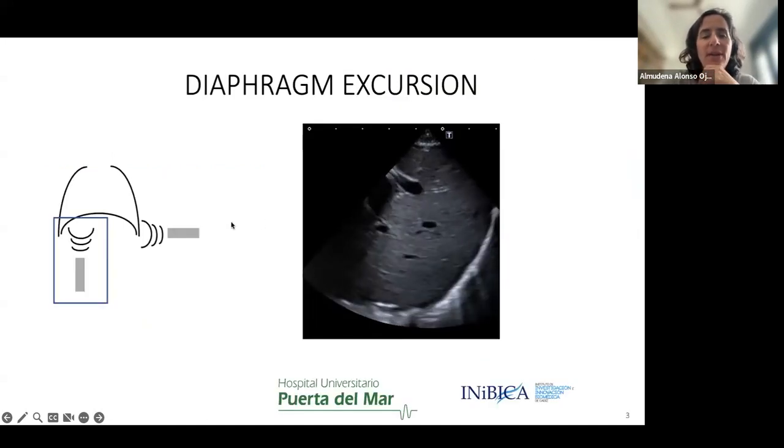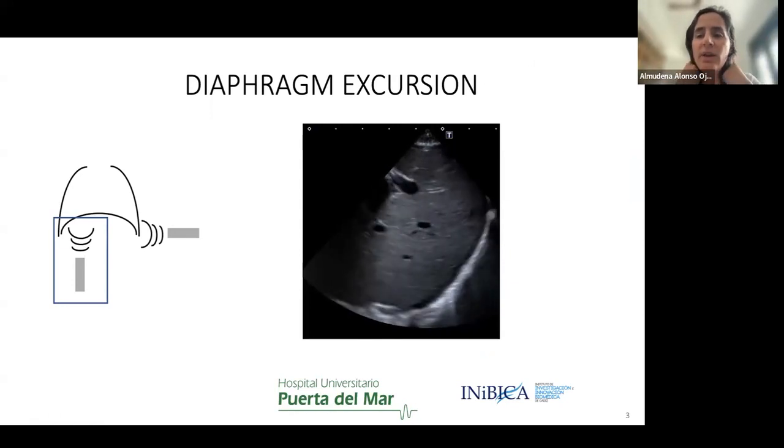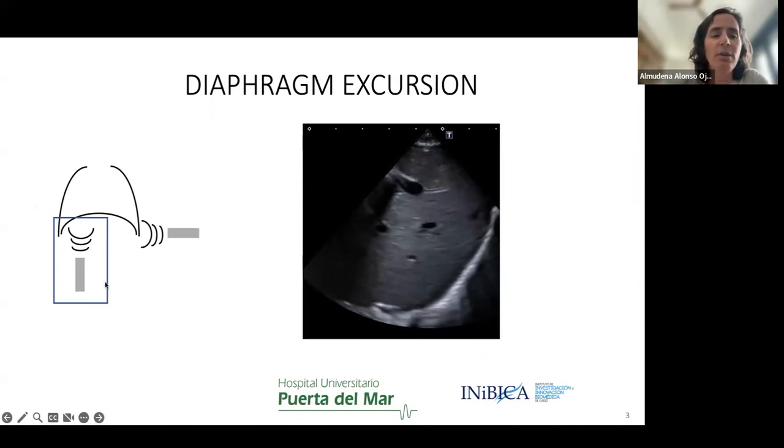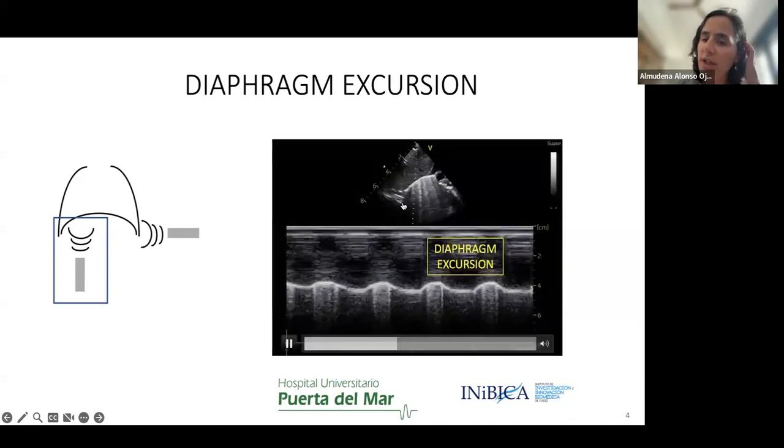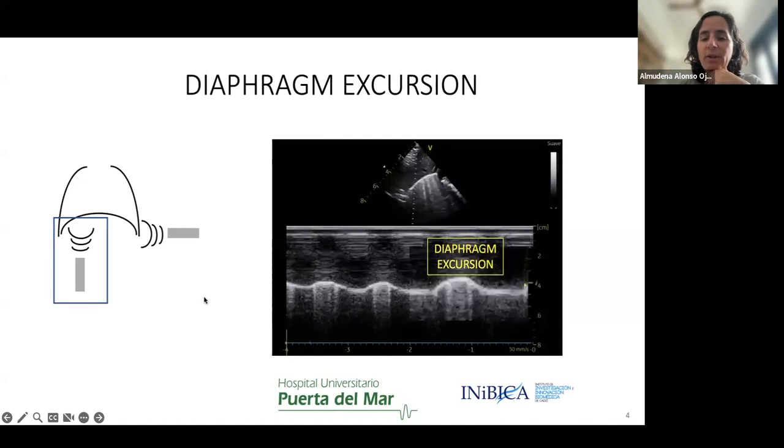This is the first measurement and the most logical one when we think about how the diaphragm is functioning. The first thing that we should be aware of is the displacement of the diaphragm upwards and downwards during the respiratory phase. In this first approach, we are looking at the diaphragm from a subcostal view at the level of the mid-clavicular line. You will see this image here in which you're watching the liver, and using the liver as an acoustic window, you can see this hyperechogenic line here, which is the diaphragm. You can use M mode there to measure how the diaphragm is moving upwards and downwards through the respiratory cycle, as you can see here.